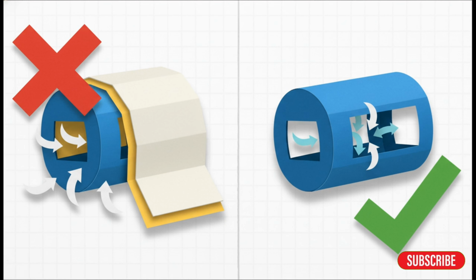For it to work, those little windows on the colored adapter, the air entrainment ports, they have to stay open to the air. If a bed sheet or a blanket covers them up, you've just turned it into a simple mask and completely defeated the whole purpose.